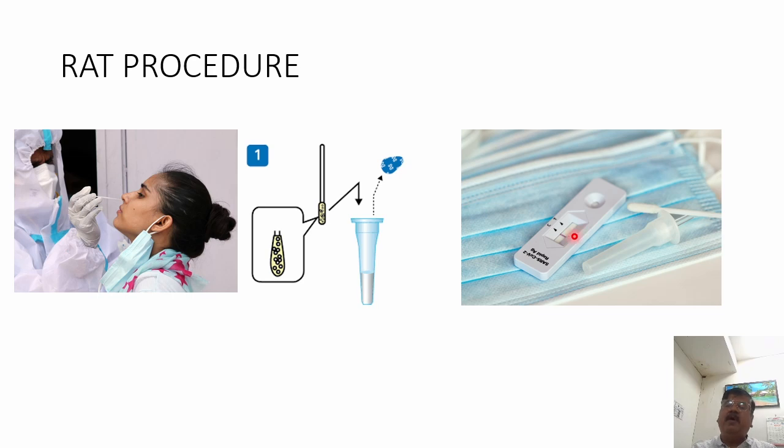It will show the test as well as the control band. If only the control comes and there is no test band, that means negative. If both bands come, it is positive.